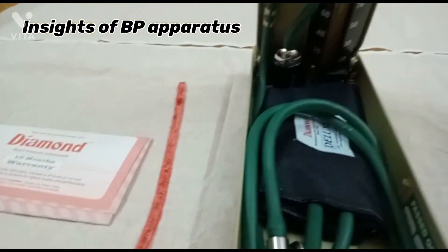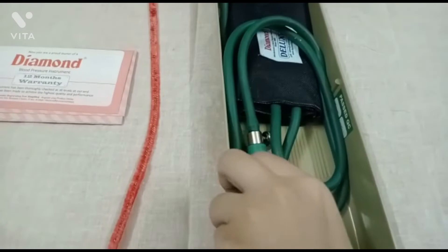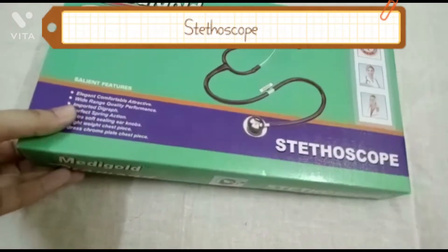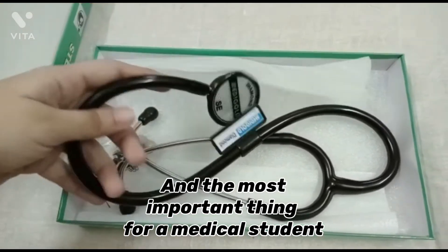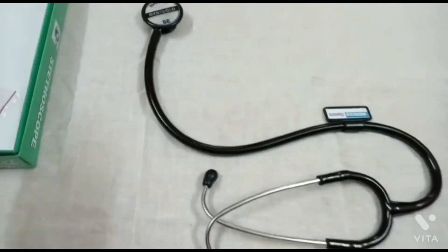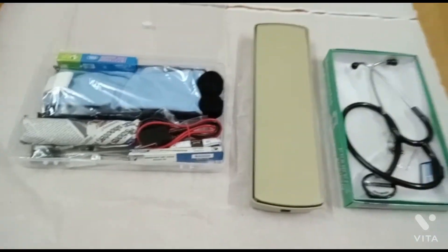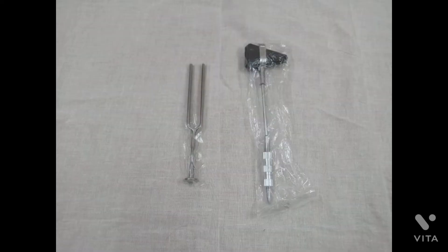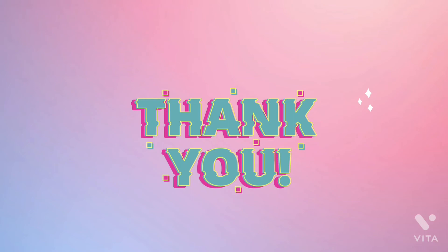Inside the BP apparatus, and the most important thing for a medical student — you can buy the stethoscope of your choice, but I would suggest you go for an affordable one. So this was all for this video. A very big thank you to everyone who stayed till the end. Do not forget to follow my Instagram channel, The Physiomedic, for daily posts and updates about physiotherapy — scope, information, and everything related to it. Thank you.